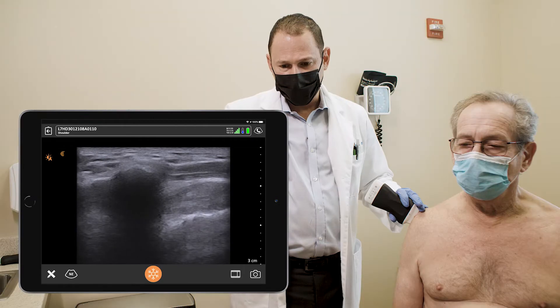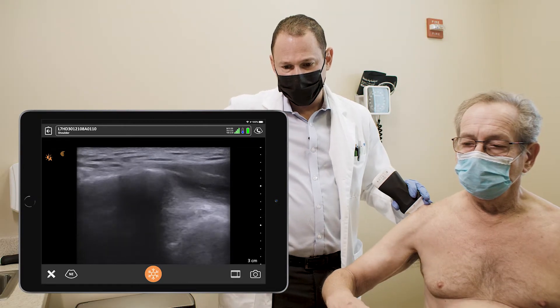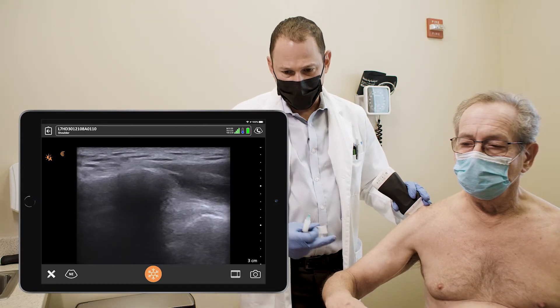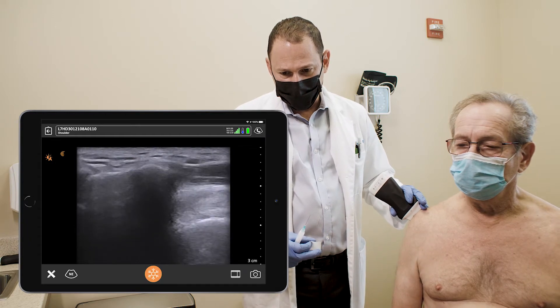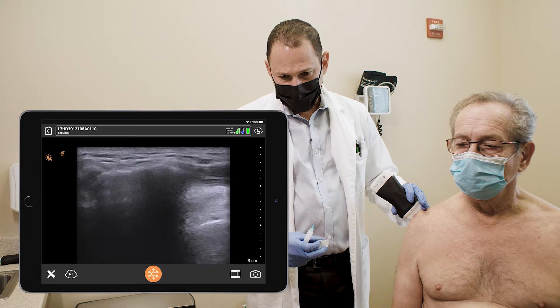Harvey, would you mind just taking your arm out to the side — you can see how the tendon disappears under the acromion. You can put it down. We're going to target the region under the acromion for the injection.